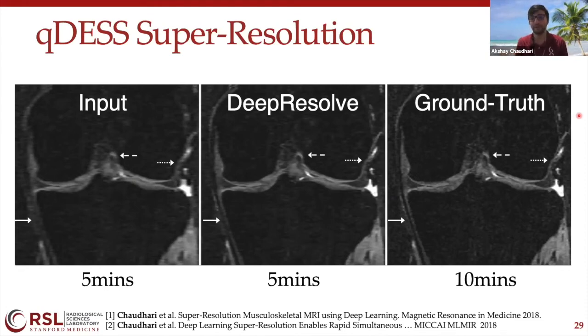So the first thing is to make sure that some of these systems can be deployed in the clinic robustly. A lot of new imaging sequences that are developed, only the people who develop those sequences can run them because they require very specific parameters. Maybe you don't reconstruct it in real time on the scanner. So being able to come up with a robust deployment package becomes very important, so that MRI technologists at your imaging center or at the hospital can run these all the time. So I think robustness is important.